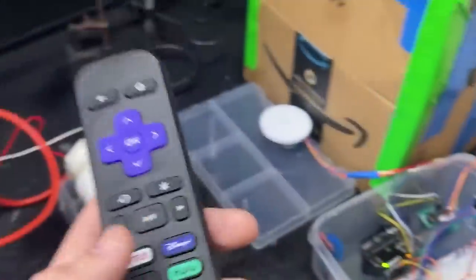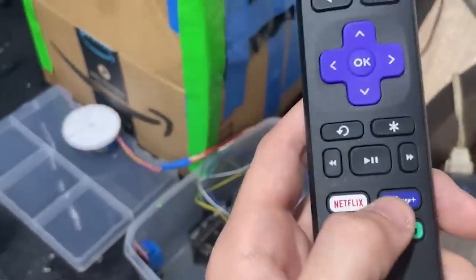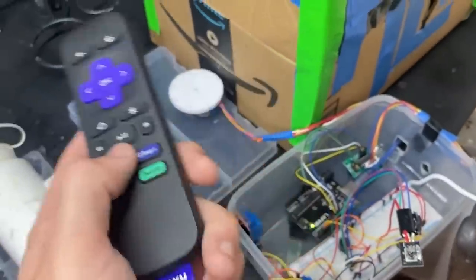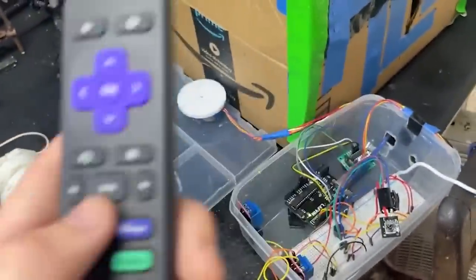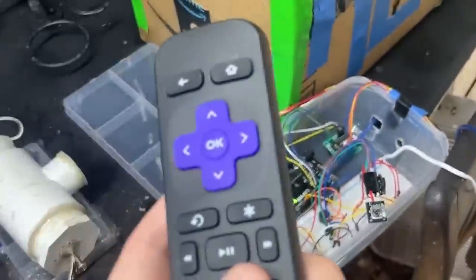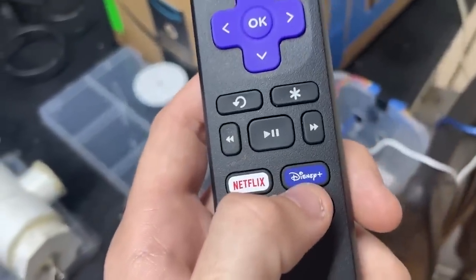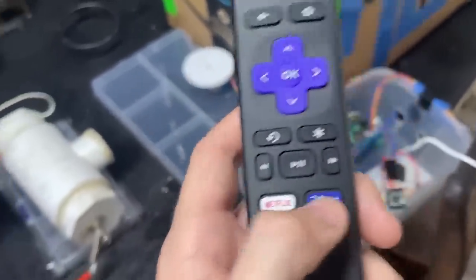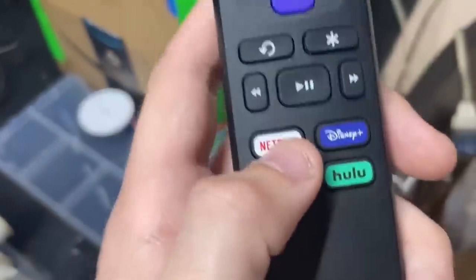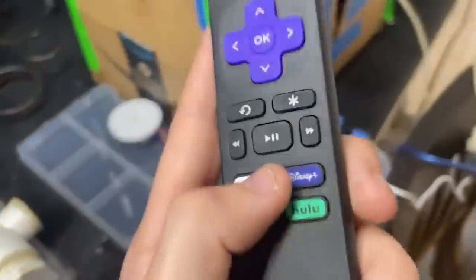I'm going to show you this thing working without the x-ray tube going first. The Netflix button does 45 x-rays for a full 360-degree rotation — 8 degrees each rotation. The Disney button does 90 x-rays at 4 degrees each rotation for a full 360. The Disney mode gives better quality CT scan results but takes longer and the tube gets a lot hotter, so you need larger breaks in between. The Netflix mode is shorter with less breaks needed.